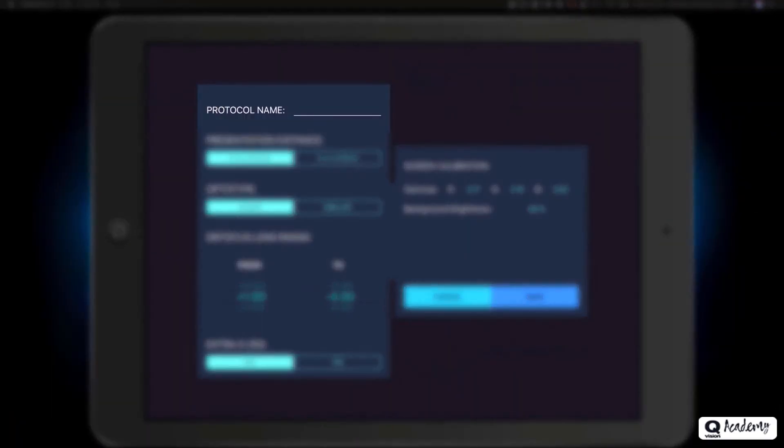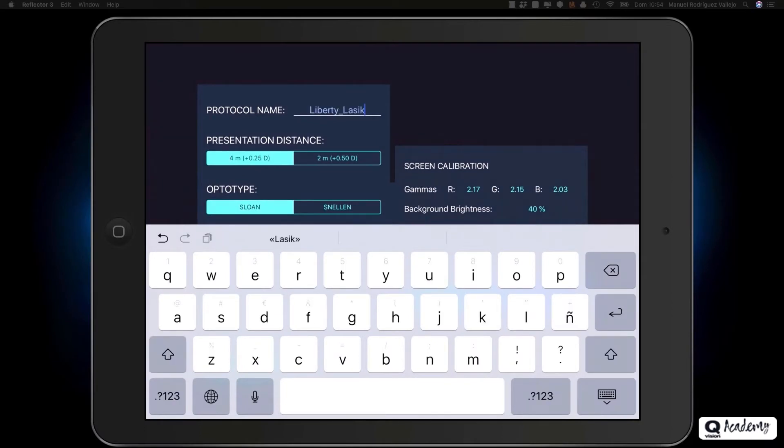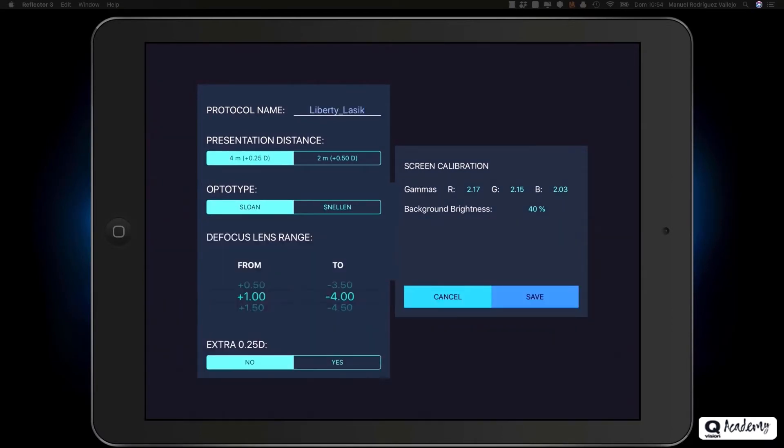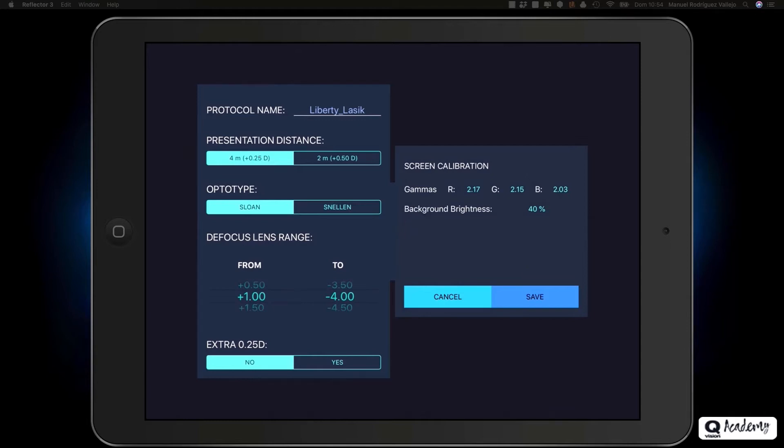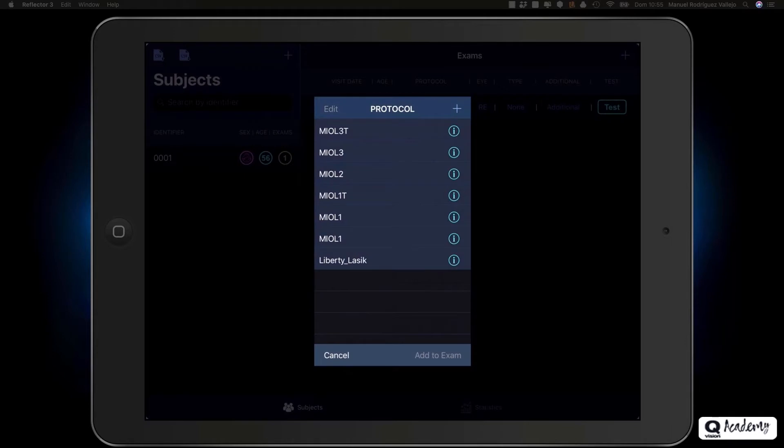Let's create our Liberty LASIK protocol. Presented at 4 meters, with Sloan letters in the default range, without the additional step of 0.25 diopters, and modifying the brightness to 40%, which corresponds to 85 candelas square meter on this iPad. Remember that this value does not have to correspond exactly to the one you have to enter, because on the iPad with which we have conducted the video tutorial, we have made a custom calibration. Click on save and we have created our Liberty LASIK protocol.